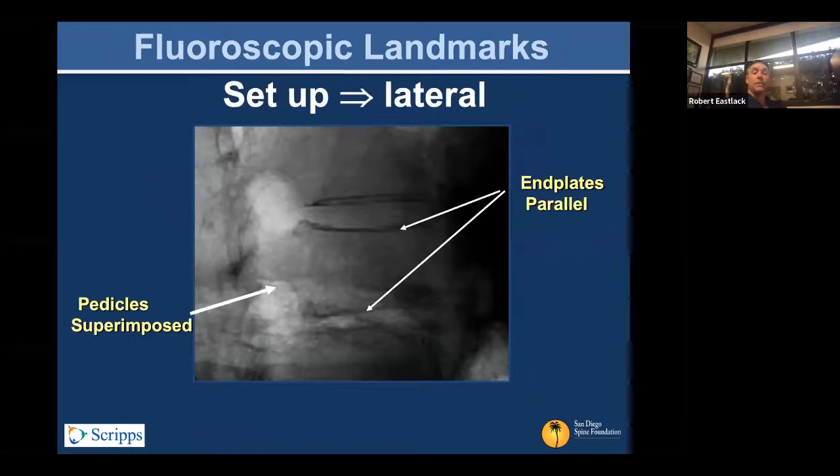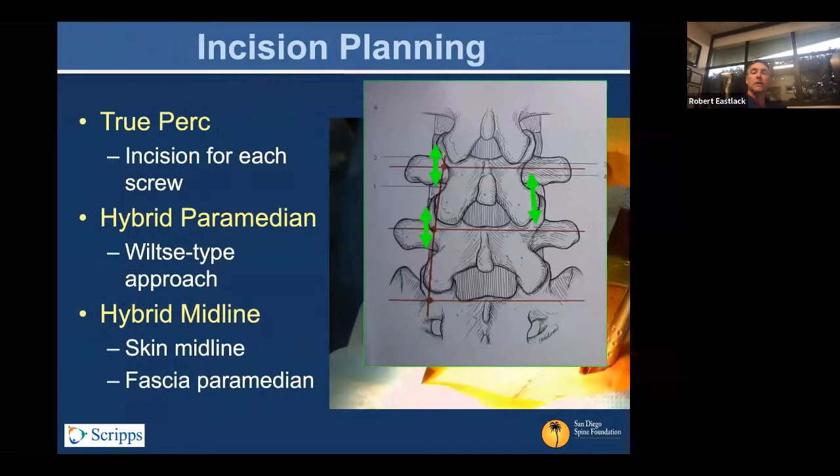You don't necessarily have to start with the lateral view, but when you're first learning this technique it's not a bad idea to get a lateral so you know you have a crisp lateral and your fluoro tech has the right position. In general, we start with the AP and wait until we get our Jamshidi needles started before going to lateral. Once you do, you want to see the pedicles superimposed, and you want en face views of the end plates — cephalad and caudad. With a trapezoidal vertebra you may not see that quite as readily, but shoot for it with normal vertebral morphology.